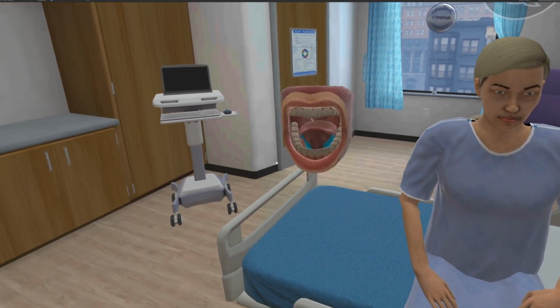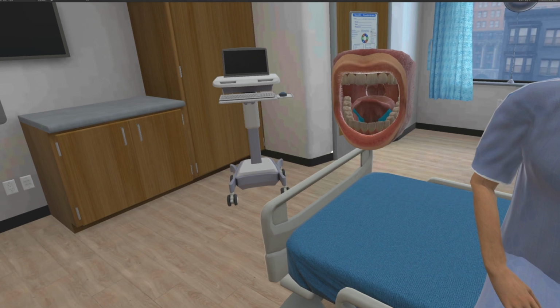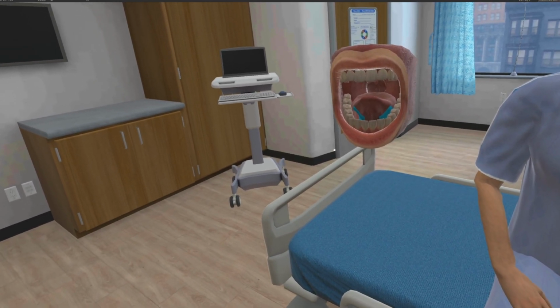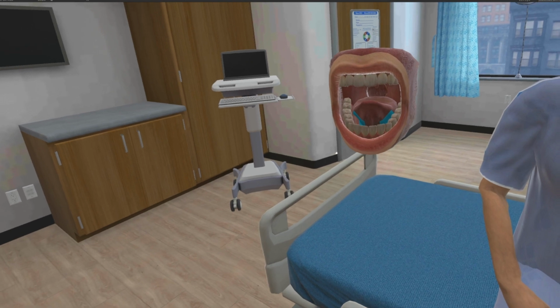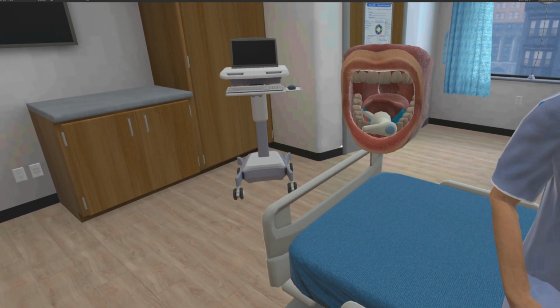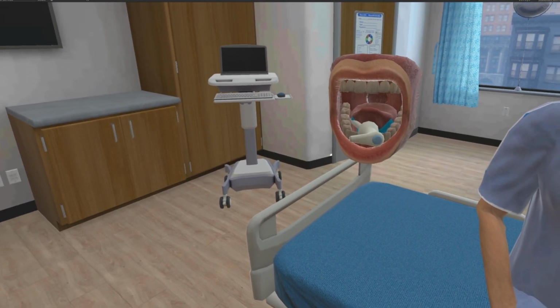When taking an oral temperature, you'll place the tip of the thermometer's probe in the back pocket under the tongue on either side of the mouth. Placing it in the front of the mouth will cause a lower reading. The thermometer tip needs to be placed here under the tongue and at the back of the mouth.